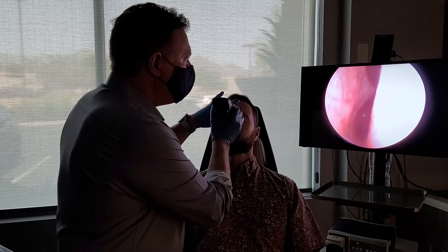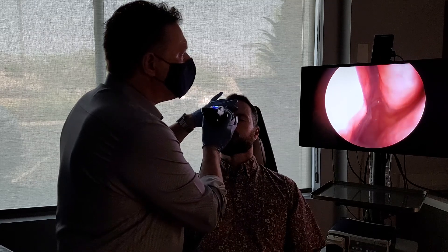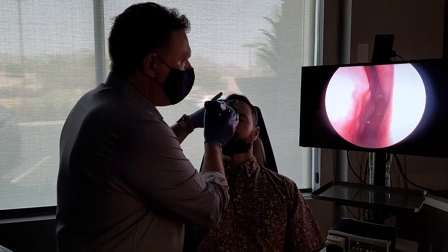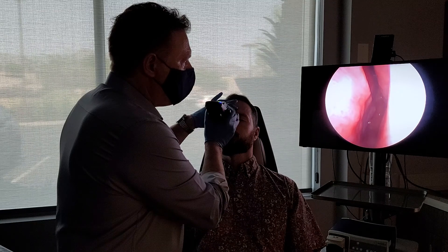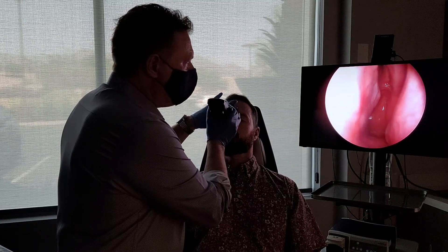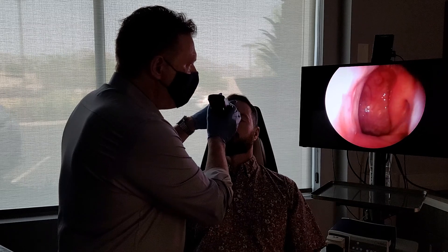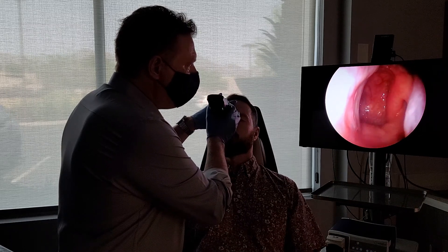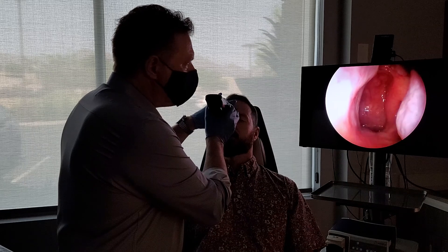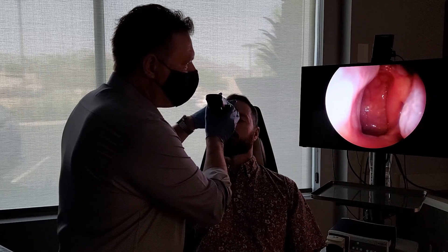Right towards the back — the middle turbinate is right to the right-hand side, septum is to the left, and the inferior turbinate is on the bottom to the right. All the way in the back, we're gonna see Kevin's soft palate. Kevin, I'm gonna have you say the letter K. K. And the word kick. Kick. The soft palate is elevating with every word and every syllable.